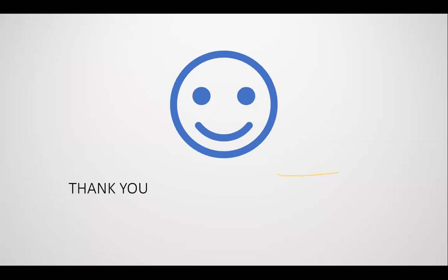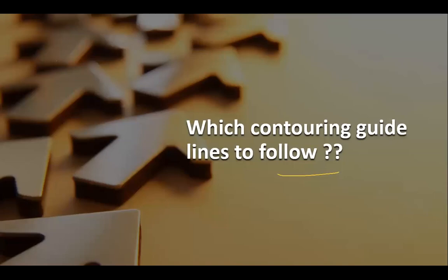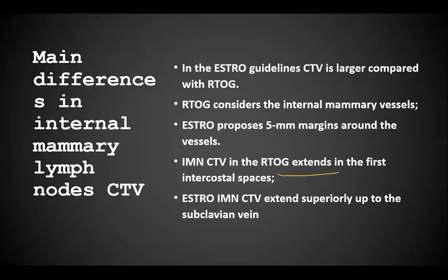Is there anything that we should repeat? So, Indira, can you just summarize the differences between the chest wall contours and the residual breast contour, and the differences between the ESTRO and the RTOG guidelines? Please summarize in one word.